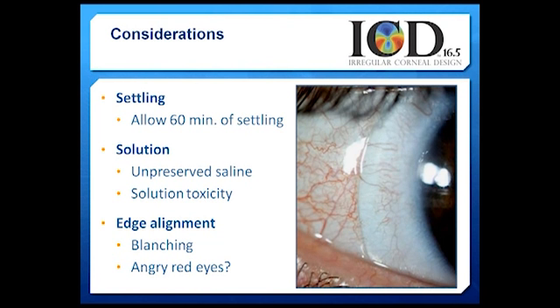A study done by John Mountford in Australia indicated that 40% of patients in the first 30 days of wear needed to remove their scleral lens at some point during the day to refresh the fluid. However, only 10% of patients after 30 days needed to remove their lenses to refresh the fluid. So this is something that we need to prepare ourselves for with scleral lenses.